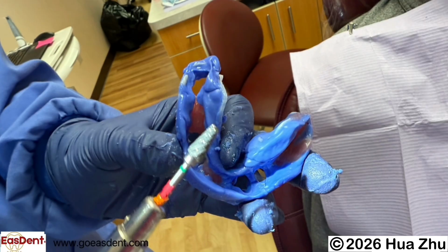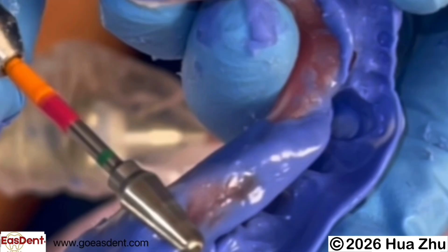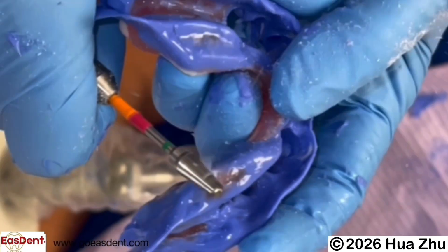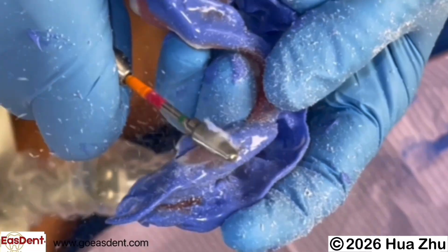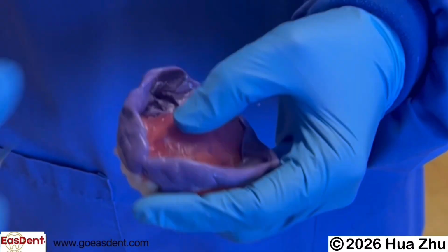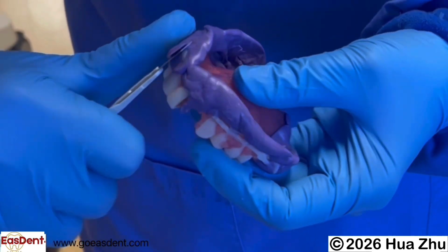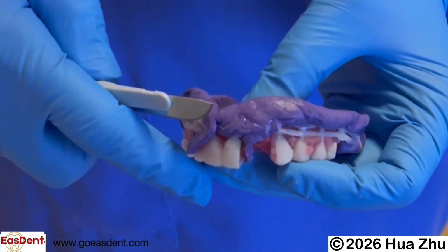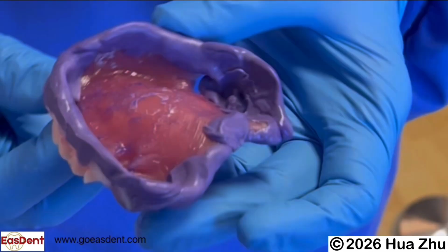After the material is set, evaluate the border again. If the previous material is visible through the new PVS material with irregular shape, it may be overextended. Grind away the irregular see-through areas. If the border is too thick, use a disc or knife to trim it down to a thickness closer to the thickness of the denture border. This will make the tray with the final impression more representative of the denture's shape. Now you have an Easdent custom tray with the teeth position and the nice border.